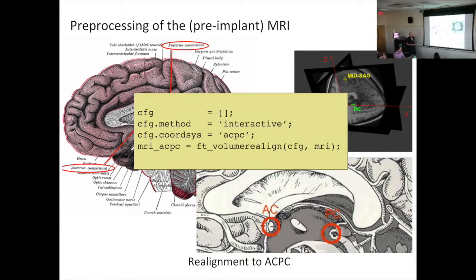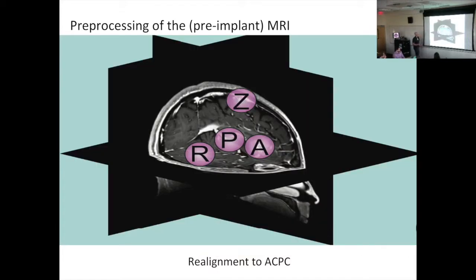That's also why I wanted to highlight it. But it's relevant so that you can quickly recognize the similarity between different software packages that basically deal with the same problem. So, what we're going to do is we're going to get our MRI in ACPC space. It's just a coordinate system. And it's the preferred convention for the FreeSurfer step that we're using next. That's why we chose the ACPC system. And we need to define four landmarks. The anterior commissure here, AC, and the posterior commissure here. On top of that, we also select, I'll show you that here. This is the tool we're using, actually, FT_VOLUMEREALIGN. I'll be using it a few times today. And this is our target coordinate system, ACPC.